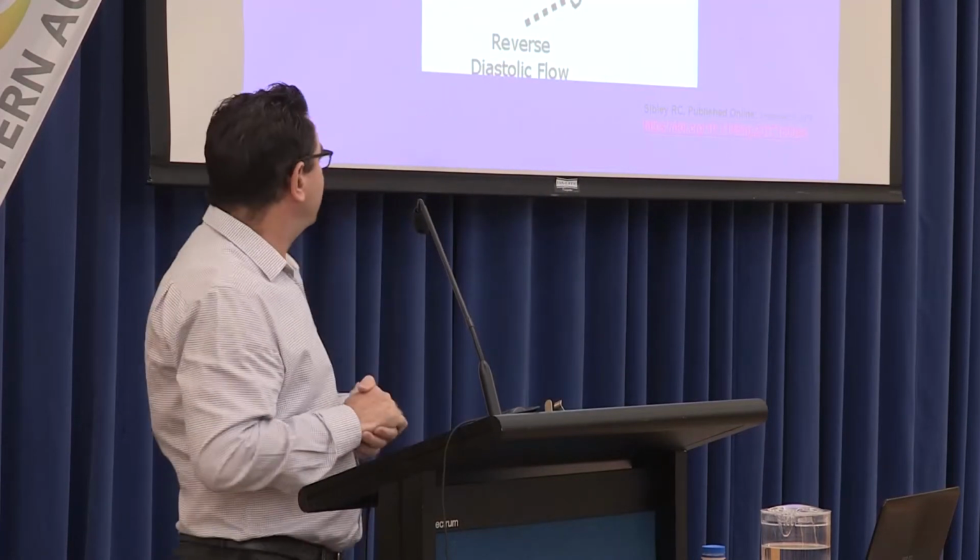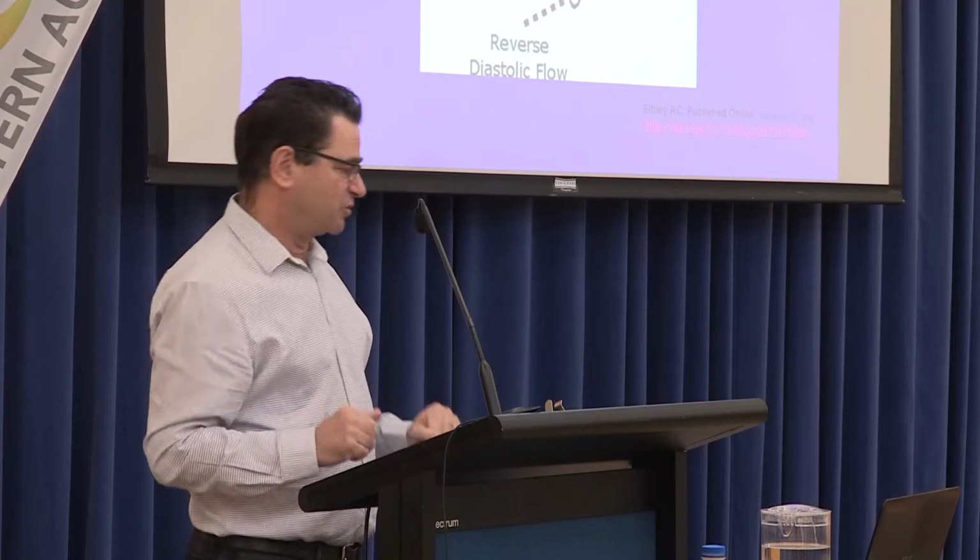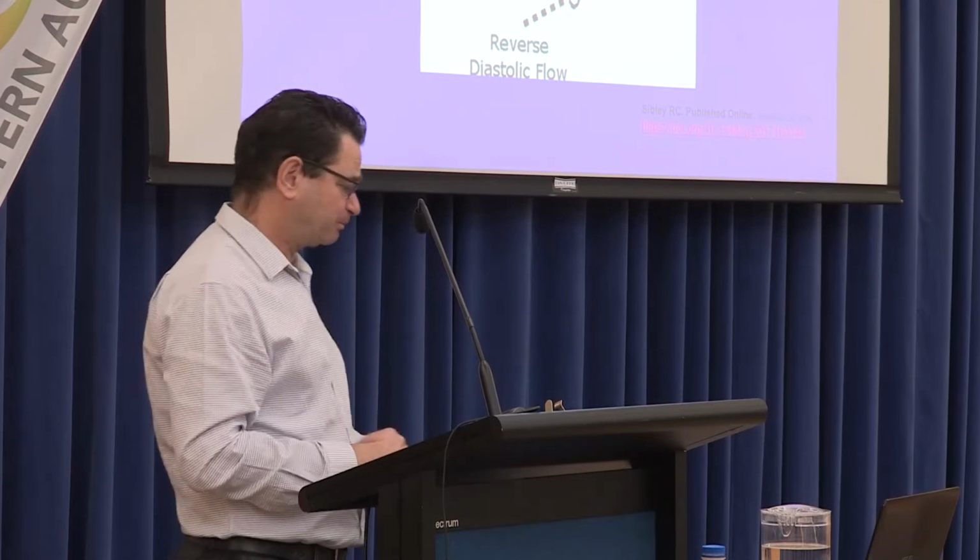So generally speaking, we get these sort of waveforms, this image I've just taken from the net, but basically we call this a triphasic waveform. Initially there's forward flow, then there's reverse flow, then in late diastole you get further forward flow. As you lose that third phase, you can get diphasic flow, which can be not too bad, and then you can get monophasic flow, which is just up and down, and we often see that in damped situations further down the leg. So that's probably less relevant. I think people get a bit too carried away about waveforms compared to just, is there a stenosis or not? And I think you can be too strung out about things that are of less relevance.